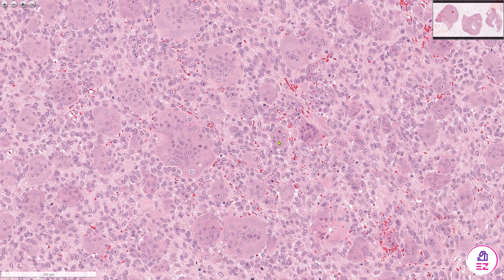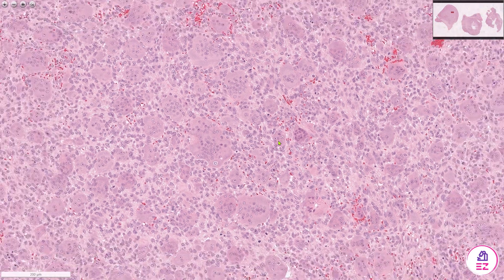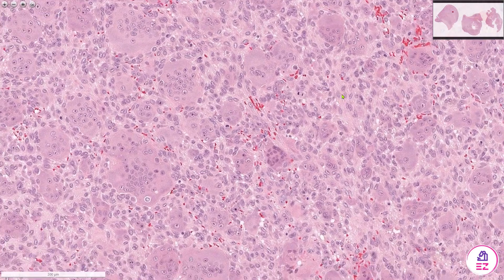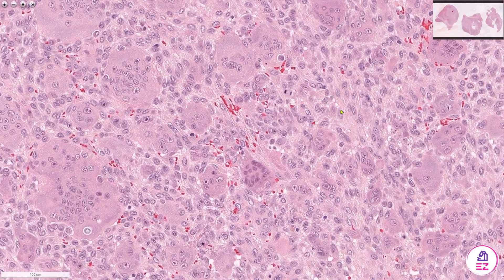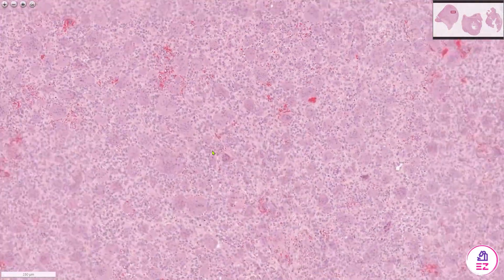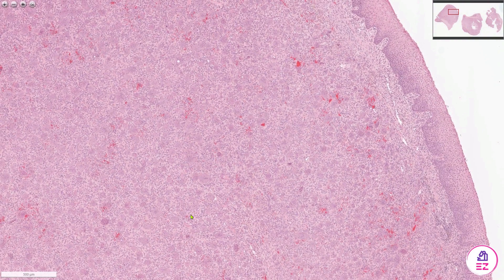As well as the multi-nucleated giant cells, the surrounding connective tissue has some mesenchymal, spindled or ovoid type cells — perhaps a modified form of a fibroblast — and we can also see erythrocytes or red blood cells scattered throughout the lesion. So all of this connective tissue is replaced by a hemorrhagic stroma containing multi-nucleated giant cells.